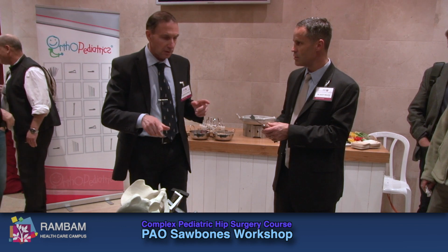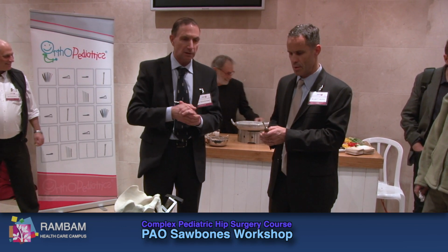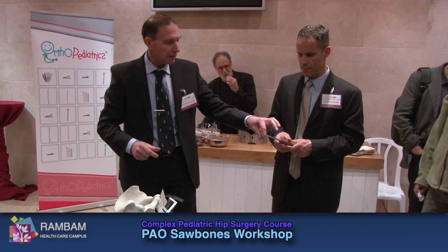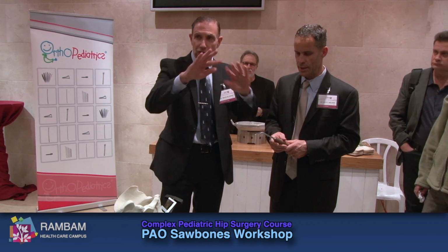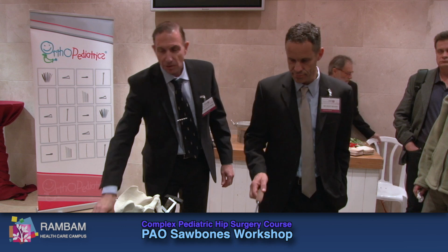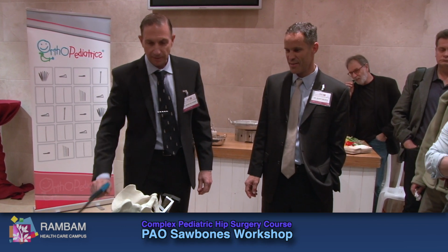No, I've got the newest set. These come with the old set. I've got the newest set and the old set. The ones with that sweeping curve, they've got a nice narrow curve. It's also hooked like this, but it's a complete blade. It doesn't have a shoulder on it. The shoulder can get stuck in the osteotomy site. So you only have this kind of saw to do your saw cuts, unfortunately, but that's okay. You should be able to manage that.